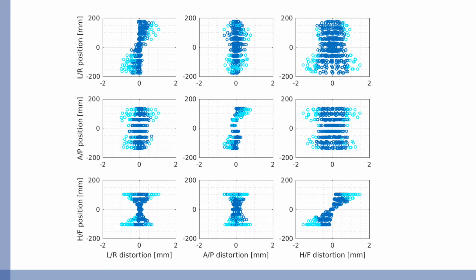At the top level is basic pass-fail information for those who simply want to know if any failures were detected. At the opposite end of the spectrum, detailed information is available for those who want it. This distortion plot is an example of that and is a way to get a visualization of the spatial pattern of the distortion. Distortion is a complicated quantity to depict because the distortion itself is a vector, and the location at which the distortion was measured is also a vector.